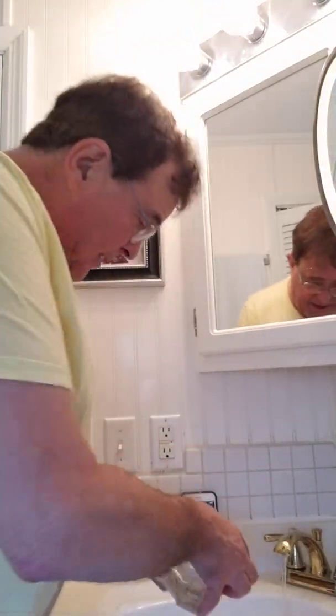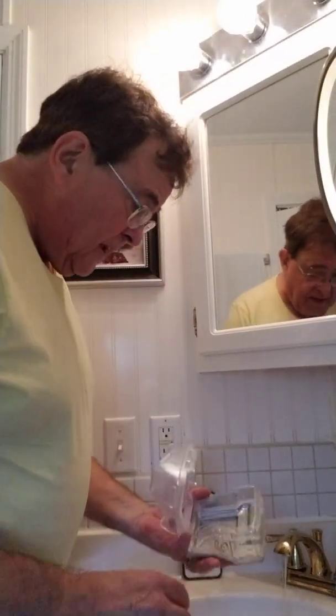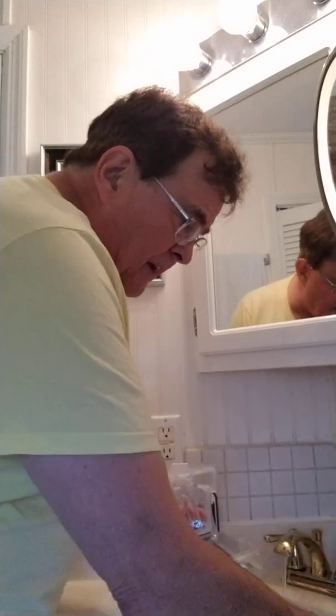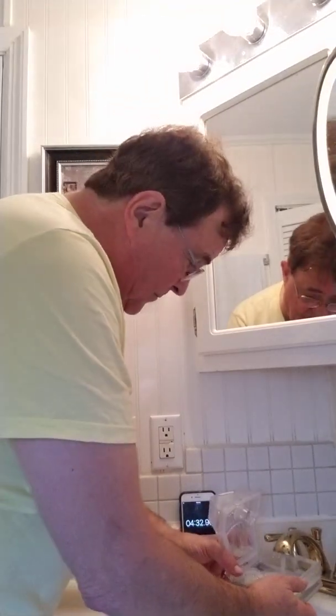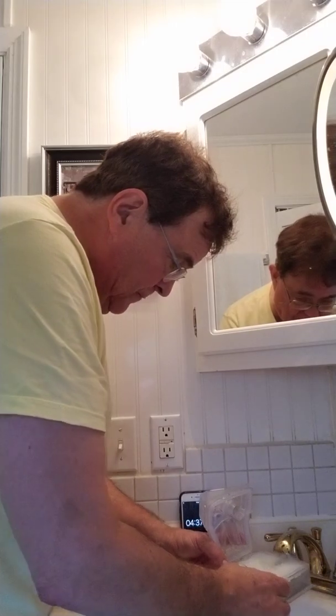Now for the tank. The tank sits there heated because we have humidity control, and it's a good thing to clean it out. So we'll pour some in there too. Not a lot. You don't have to do a lot. Now I'll turn on some more water here to get it all sudsy. We're going to fill the bottom reservoir first, part of the reservoir.